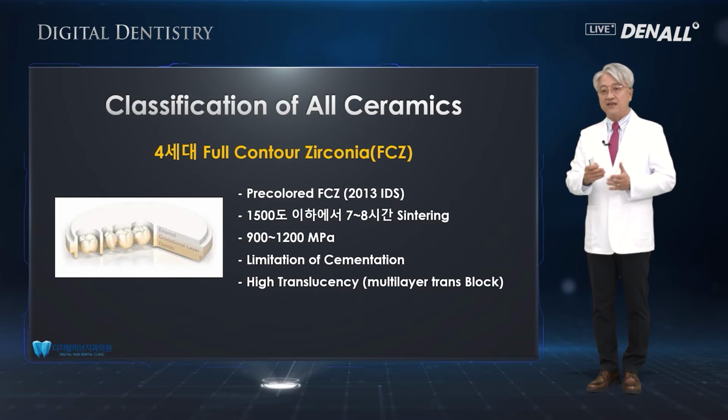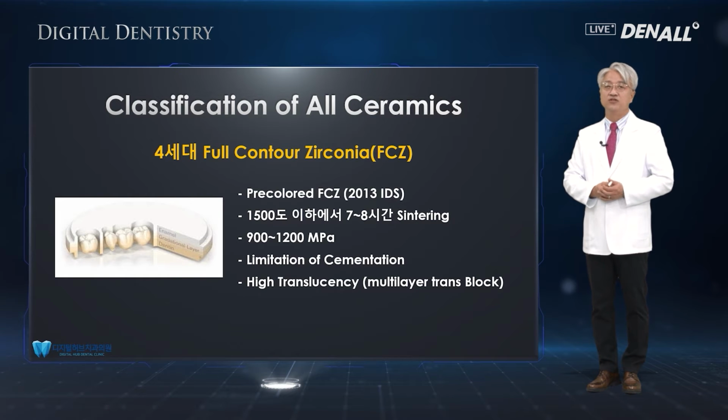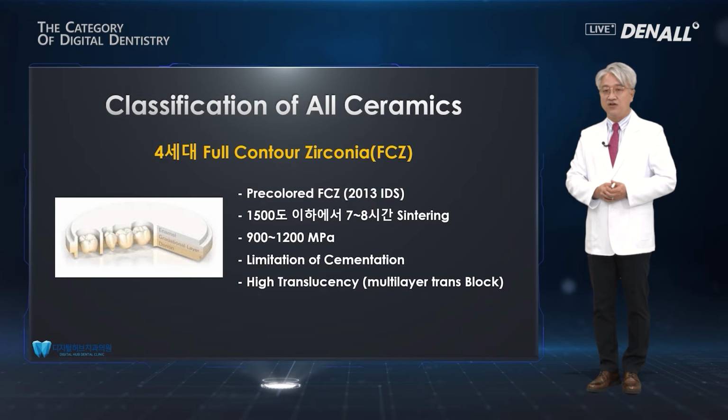But in the last 1 or 2 years, very translucent blocks are available, and multi-layered gradation blocks are also available. So even for all ceramic on the anterior side, zirconia has become a very attractive alternative and example.